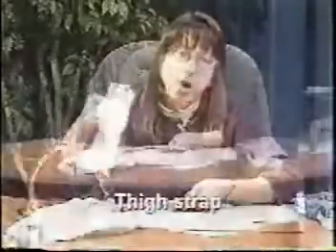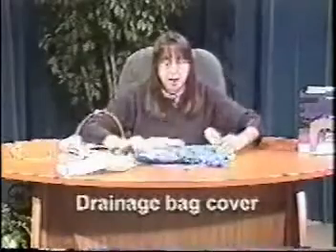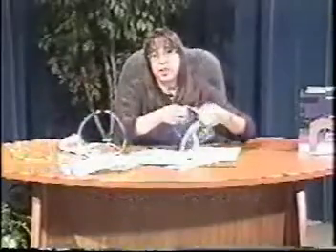In order to prevent pulling of the tubing, a leg strap will be applied to the thigh. And this leg strap is connected to the catheter after it's applied to the thigh, and that will prevent it from pulling out. In order to provide dignity and privacy for the resident, we will also use a catheter cover bag, and this bag will cover the drainage bag. It will be applied when the resident is at the bedside or in their wheelchair, or when they're walking, perhaps with the walker. Sometimes they will be applied to the walker.